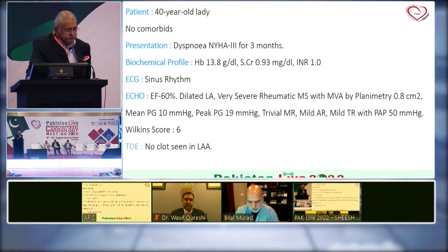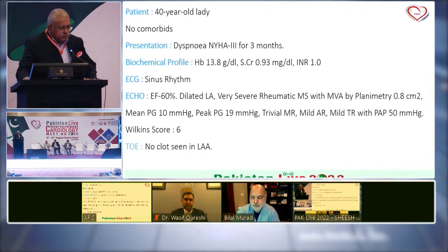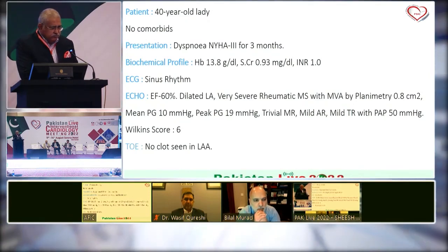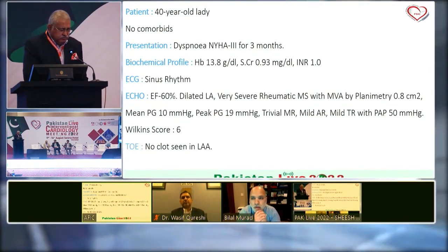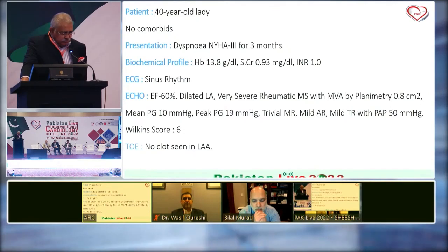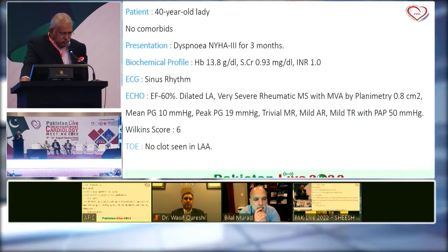And if there's calcification, you must make sure that it's not at 3 and 9 o'clock, because that's where the commissure splits. So if there's calcium there, you will tear not at the commissure but along the line of calcification of tissue and have an MR. I've done lots of densely calcified valves with PTMC, and as long as the 3, 6, 9 o'clock angles are okay, things are fine.